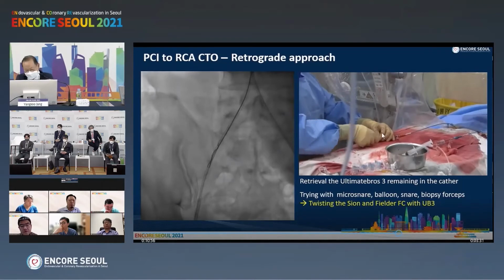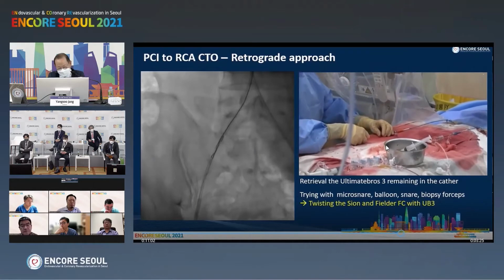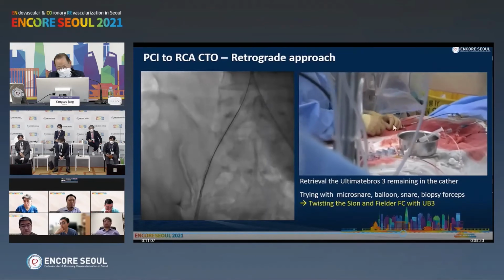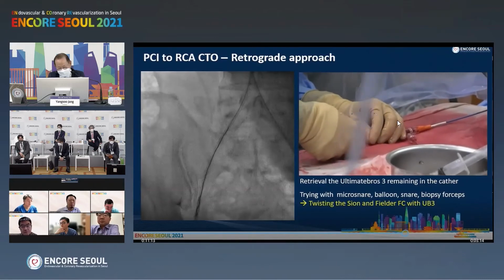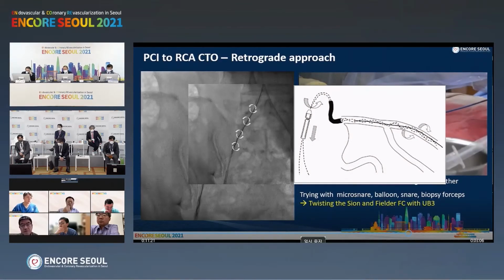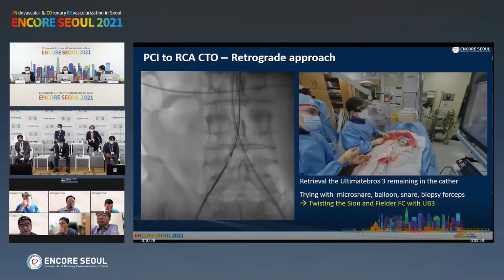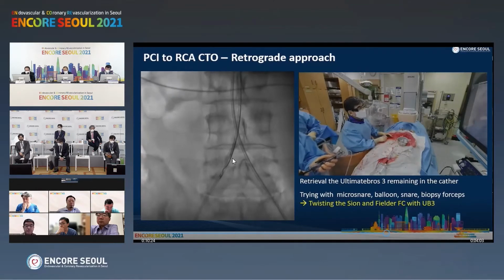Then Dr. Hyo-Soo Kim offered me, why not do the braiding two-wire technique? Okay, I remember. So I introduced two wires. Or you can dilate the balloon at the end of a wire and remove the guiding catheter. It was impossible to pass the balloon over the wire. The balloon slipped, just slipping.